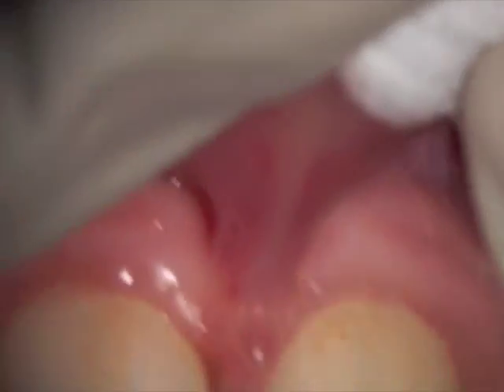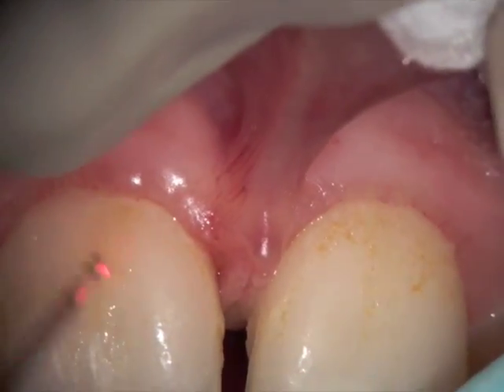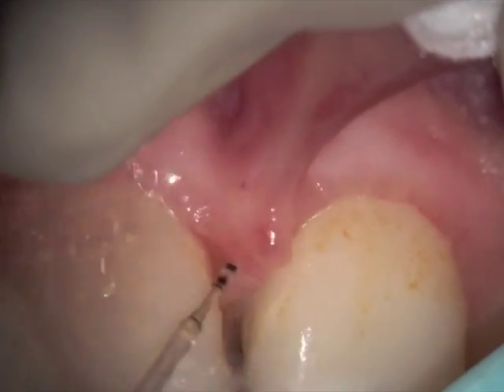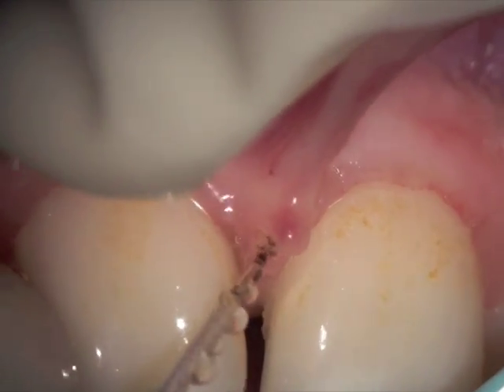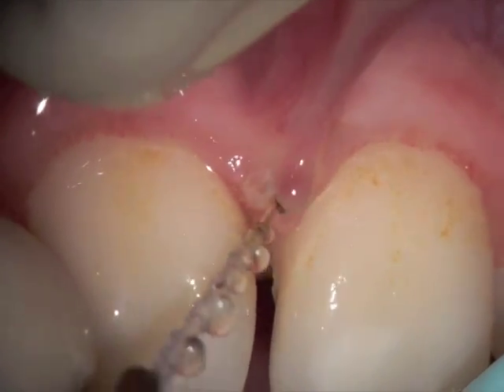The tip is initiated — it's been properly cleaved and stripped — and now we're using a three-watt continuous wave with a fine stream of water blown on to just cool the tissue initially.